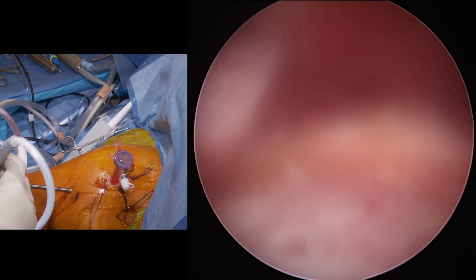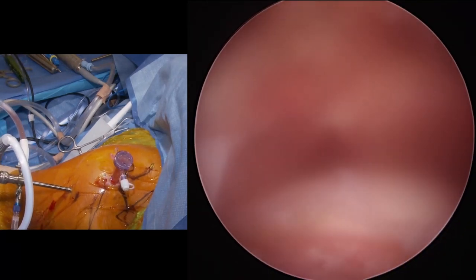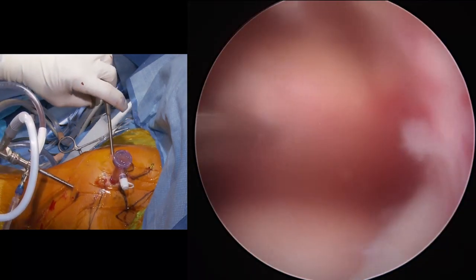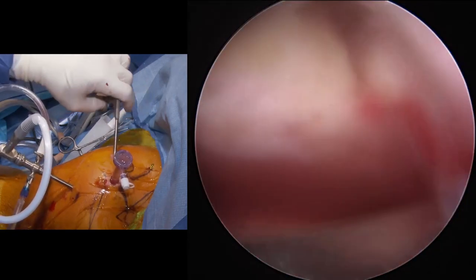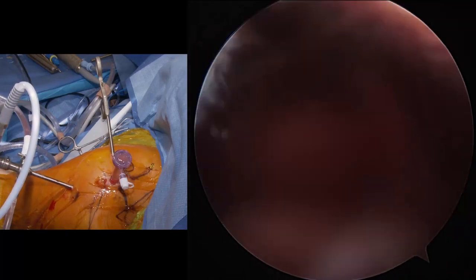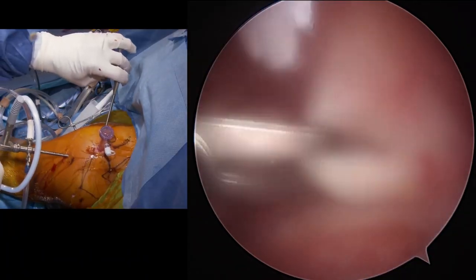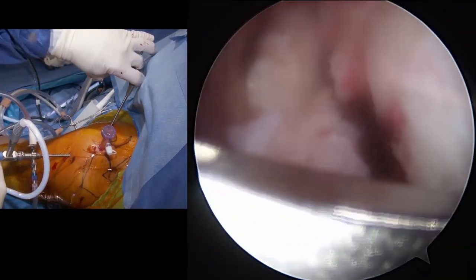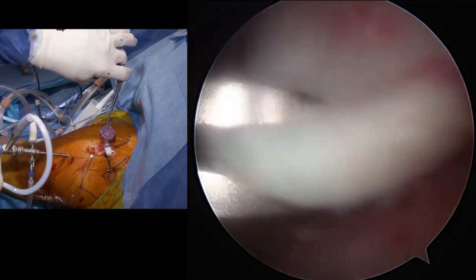Okay, so let's have that kingfisher. Just make sure we're happy with that coming all the way over, because we're kind of repairing almost on the side here. So that's the corner. Gotta find the right corner here. And that's not the corner, it's a little higher. This is the corner. And that's got to get a little work done, and then we can do side to side once we get it over. But that's what we have to do.